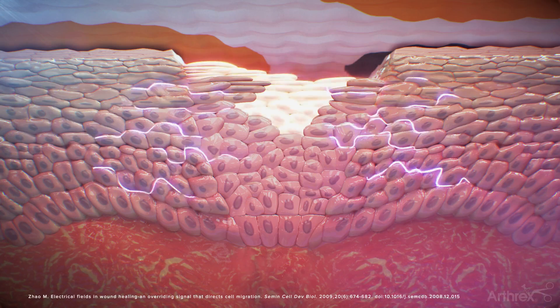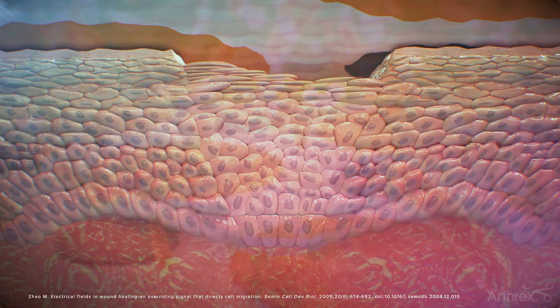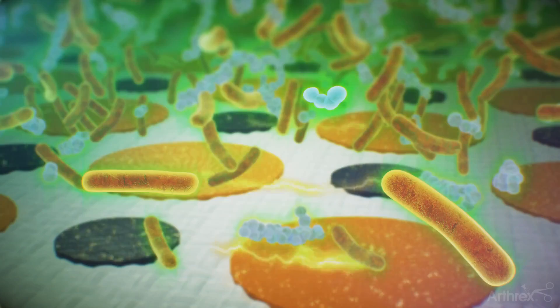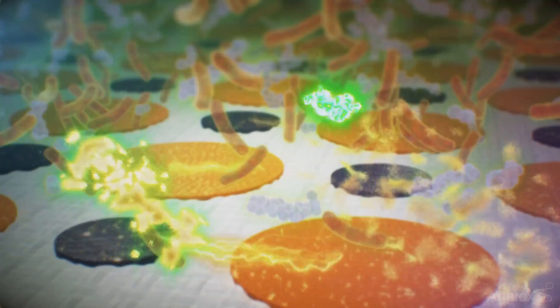Applied to the surgical site either before and/or after surgery to help reduce the risk of infection, Jumpstart has been proven to kill a broad spectrum of bacteria, including bacteria that have been shown to be resistant to antibiotics.